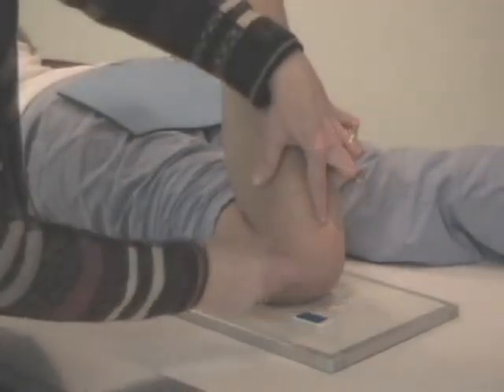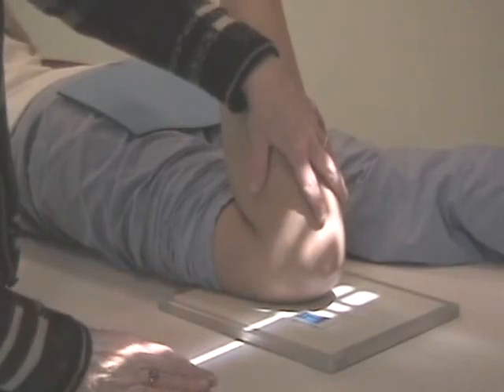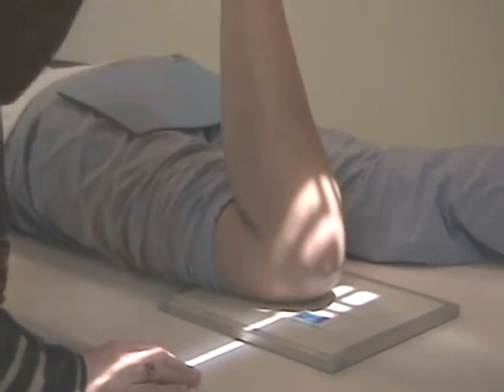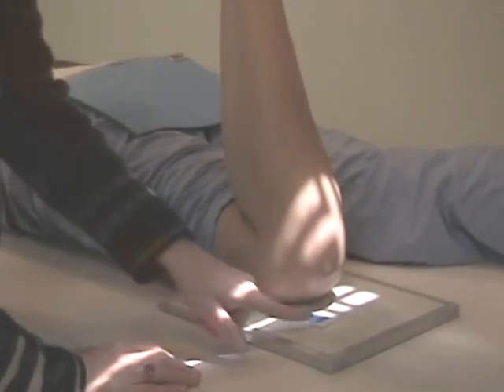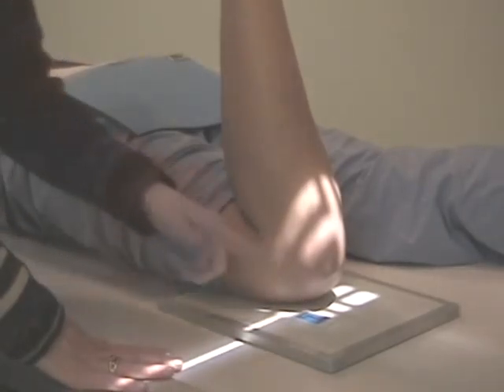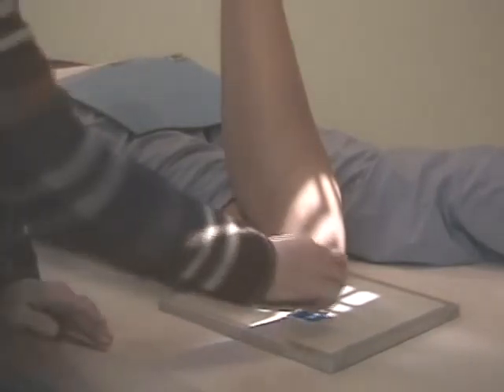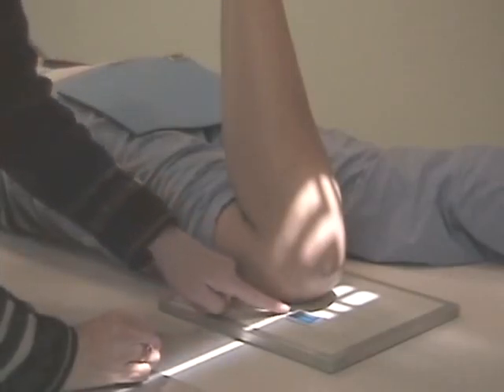It's parallel to that. I actually had to switch to a left leg so you could see it better from the camera. So this is now a left leg setup, but she's in a prone position, and we want to think about the sun over the mountain, and your marker is the moon. And so I'm looking at the sun and the moon, and that's how I have the left marker. It's to a lateral side, but that's how I read it. You know, we don't want it like this. Your moon would be upside down. Okay? So, left marker.